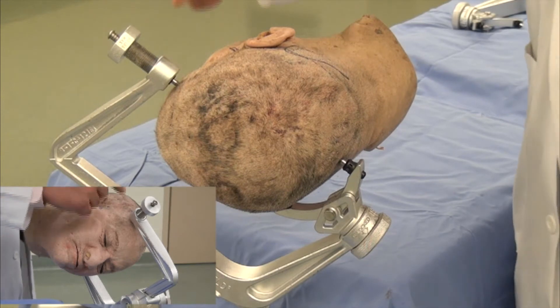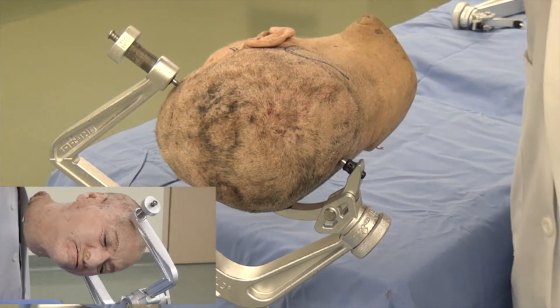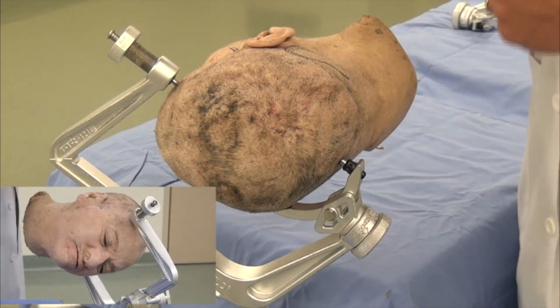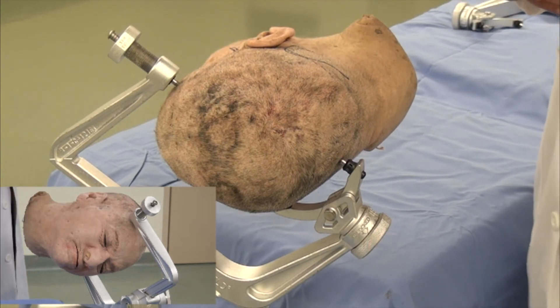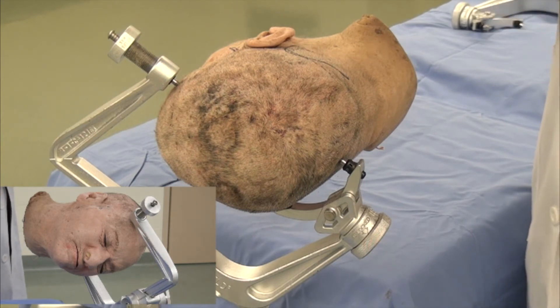The single pin is placed just behind the hairline and above the superior temporal line. As you can see, the clamp is again slightly rotated across the horizontal plane in order to avoid this single pin from being in the forehead and the potential undesirable cosmetic deformity associated with having a hole on the forehead.